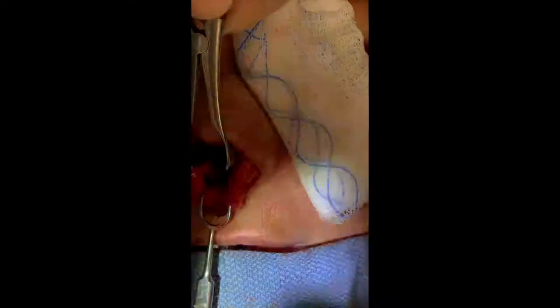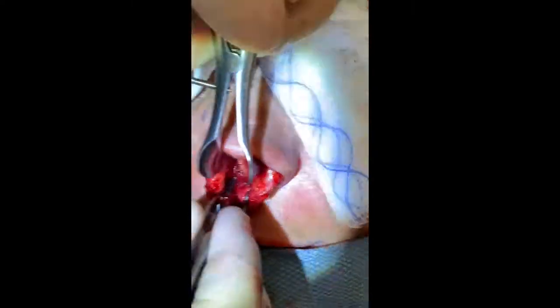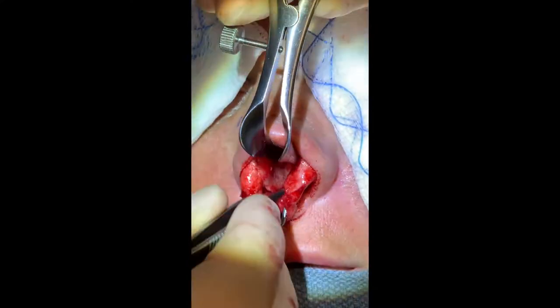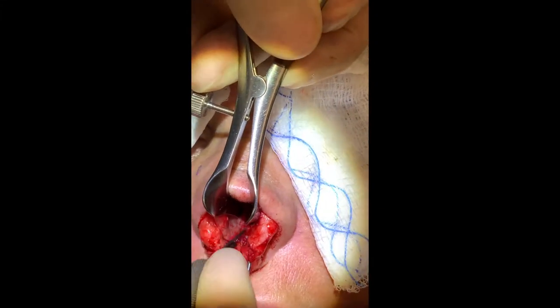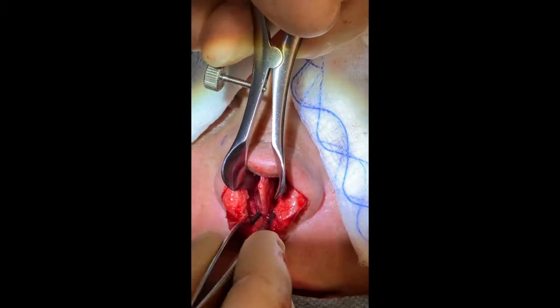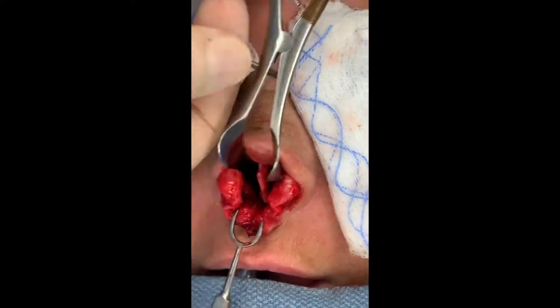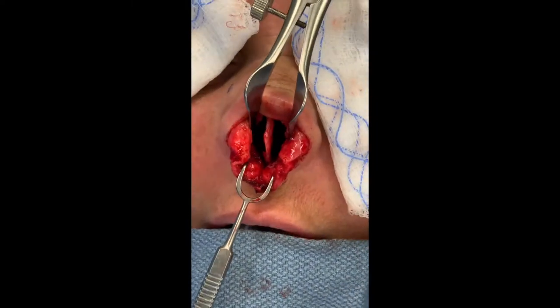A freer elevator and/or 15 blade scalpel was used to resect redundant cartilage deviated off the midline on the left. And sometimes you have to go back much farther than you might anticipate with this maneuver so that you can fully reposition the septum over the midline of the maxillary crest.